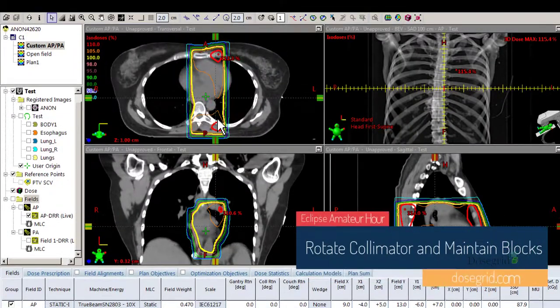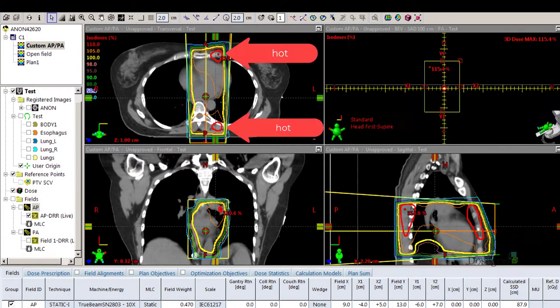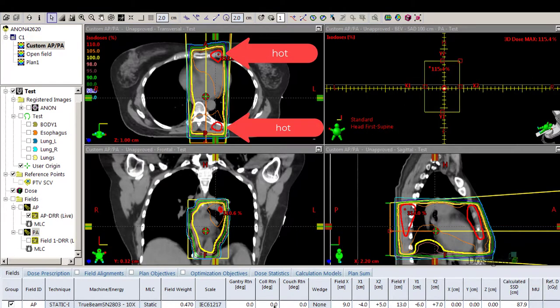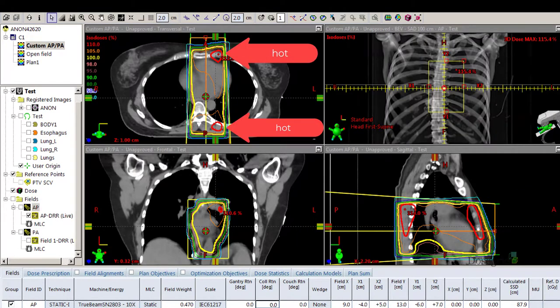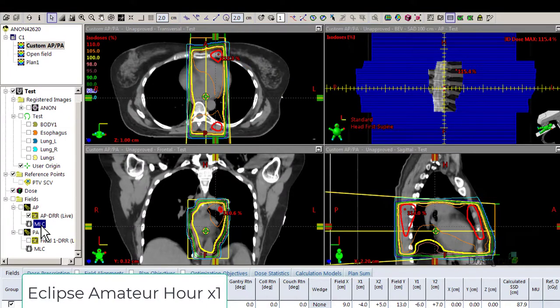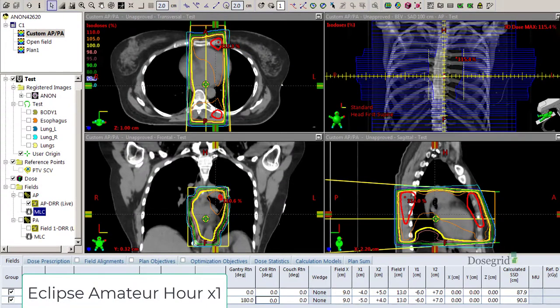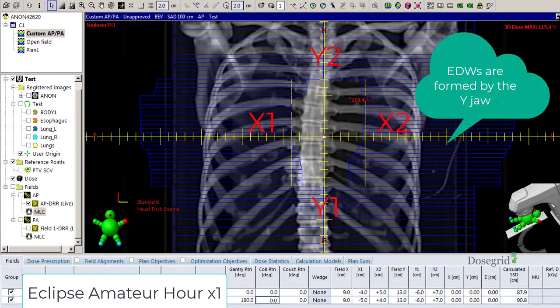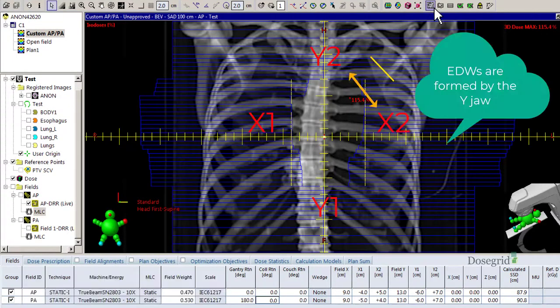We've all been here. The doctor draws custom blocks in SIM, but you need wedges for that nice plan. The collimator is at zero, so you can't use them because the Y jaw is in the incorrect orientation.